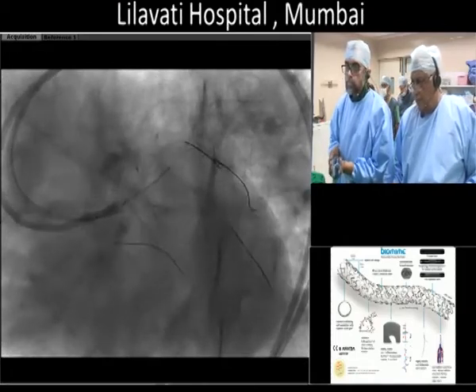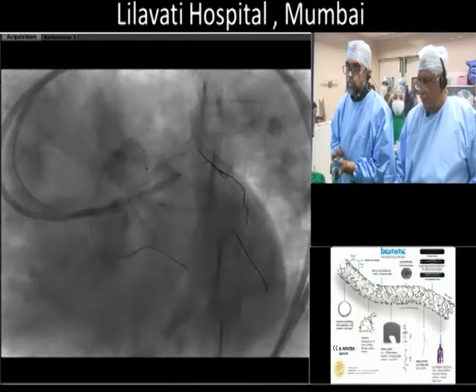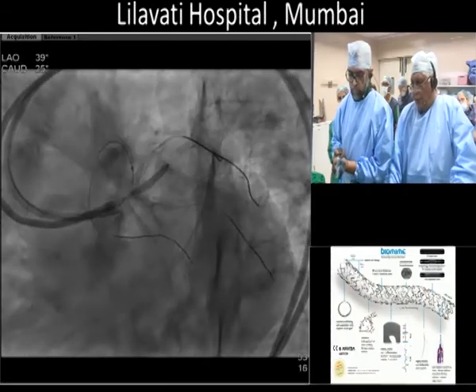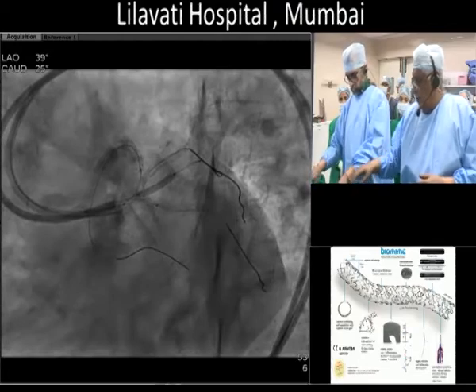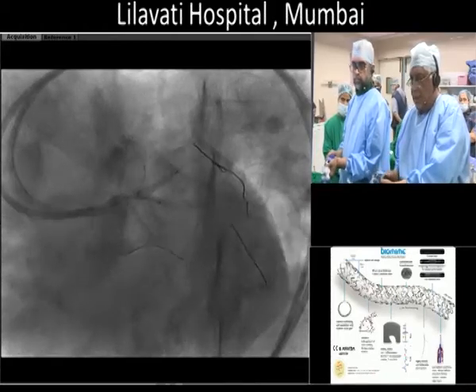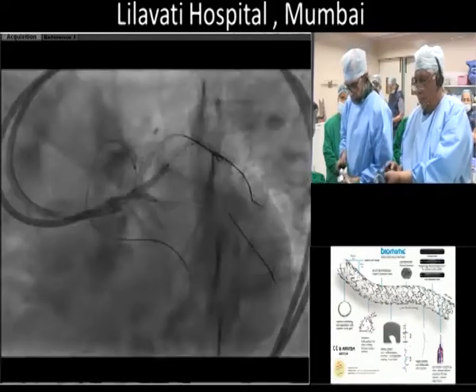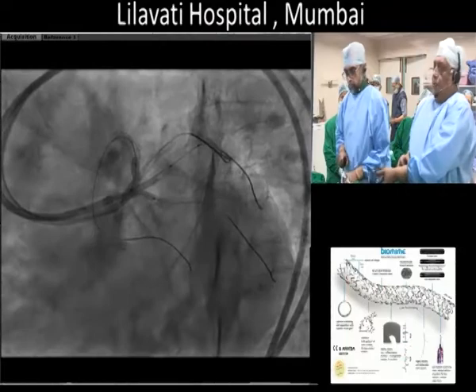So I think they often refer to this as a ping pong technique, with bouncing the catheters in and out to get sequential balloons in. This is one technique also for perforations, ping pong technique for retrograde left-to-left CTOs. Dr. Mathew is showing this as a beautiful, it's almost a quadrification. There you go. Look at that. Love it.